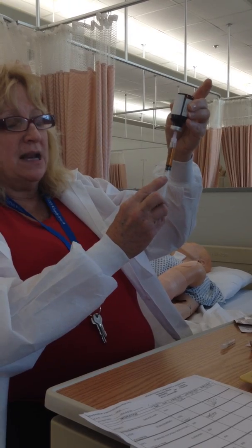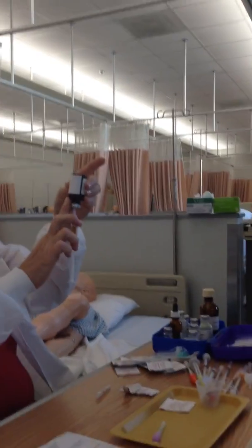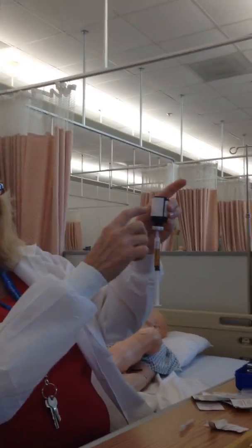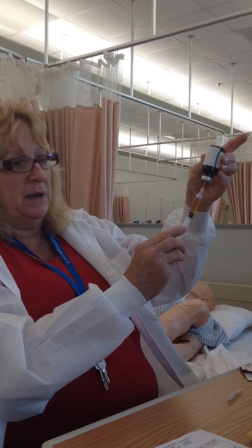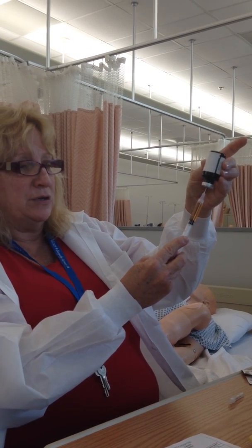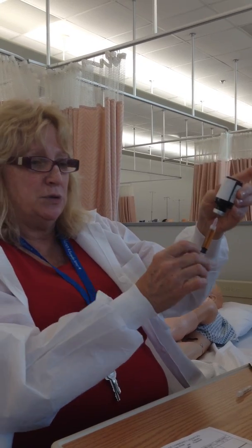Now, notice that I'm sucking air because the vial is almost empty and the needle is long, so it's up in the air pocket. You might have to draw the needle down a little bit if you start getting air before you get your dosage. So now I'm at 2.